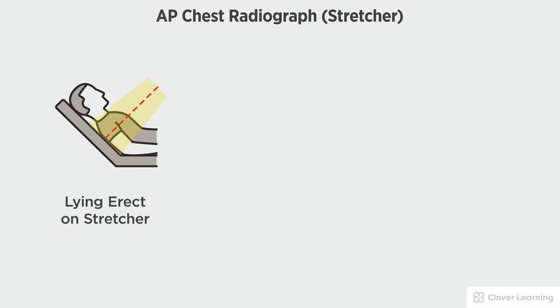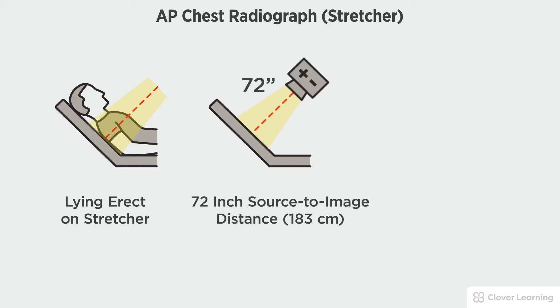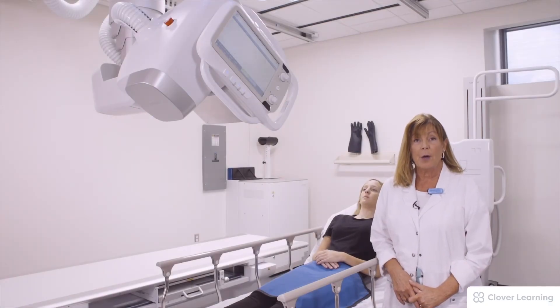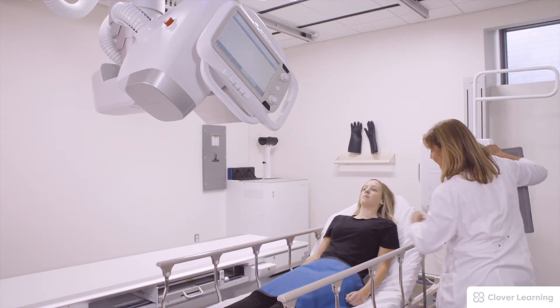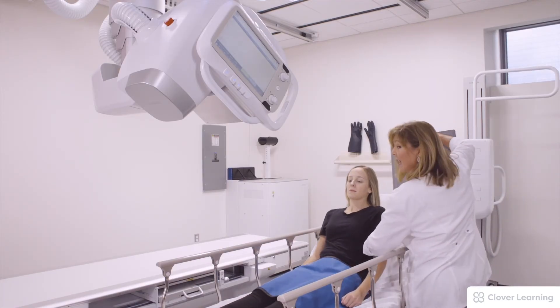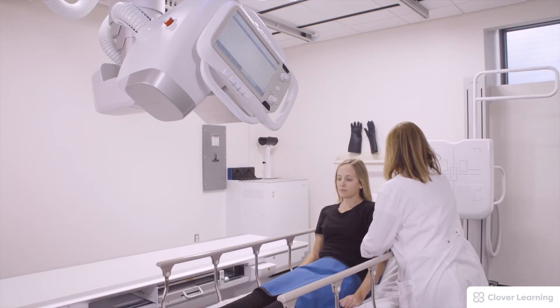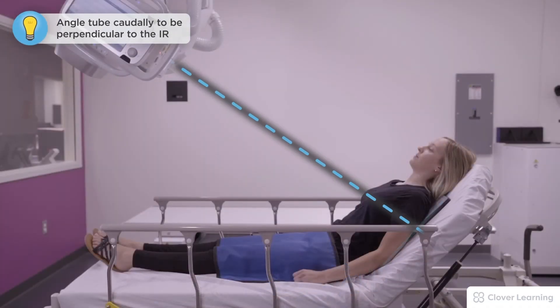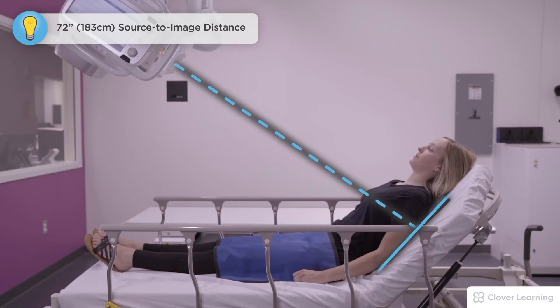In this view we will be demonstrating an AP chest with the patient semi-erect on a stretcher or a hospital bed. The head of the stretcher should be adjusted to place the patient's chest as erect as possible, with a 72-inch source to image distance and the tube angled caudally to match the angle of the image receptor. For an AP stretcher chest, our patient is unable to stand. I'm going to have my patient lean forward and I'll slide the IR down behind her. We bring the head of the stretcher up as much as the patient will allow, using a slight caudal angle so that we are perpendicular to the IR and to her sternum.